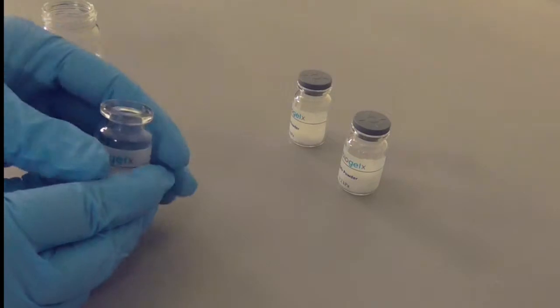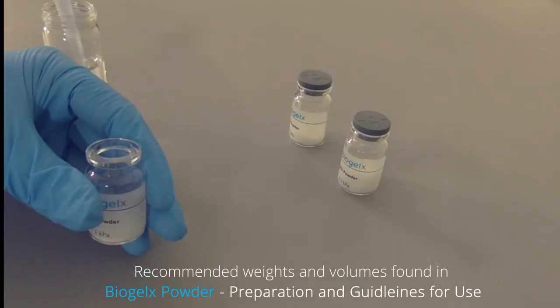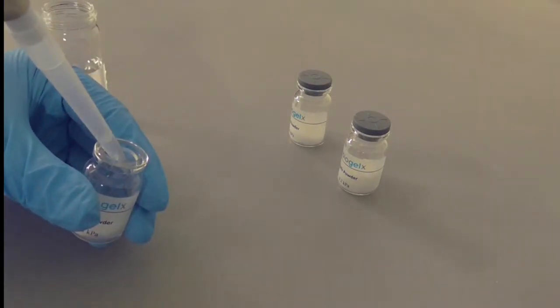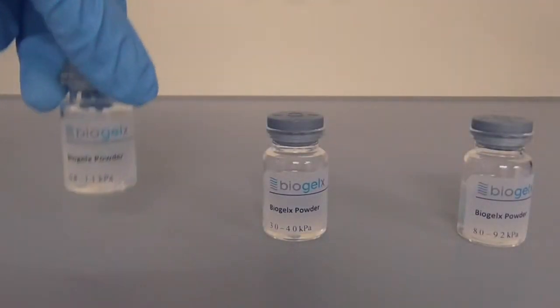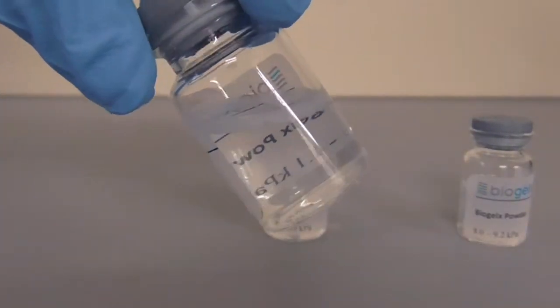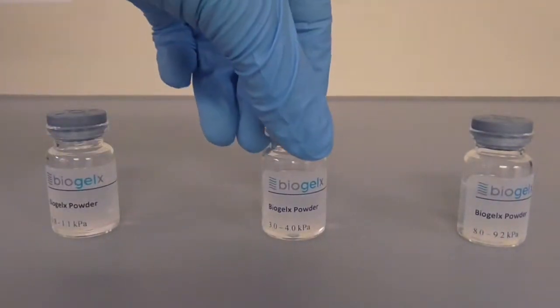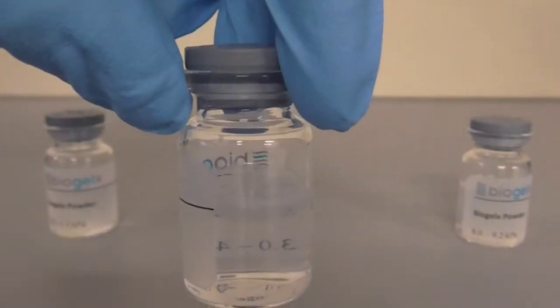To prepare pre-gels, weigh out the required quantity of Biogelx powder. Then carefully pipette the required volume of sterile water into the vial. After approximately 30 seconds of mixing, the powder will completely dissolve, leaving a clear pre-gel solution. Pre-gel solutions of higher concentration can be more viscous.